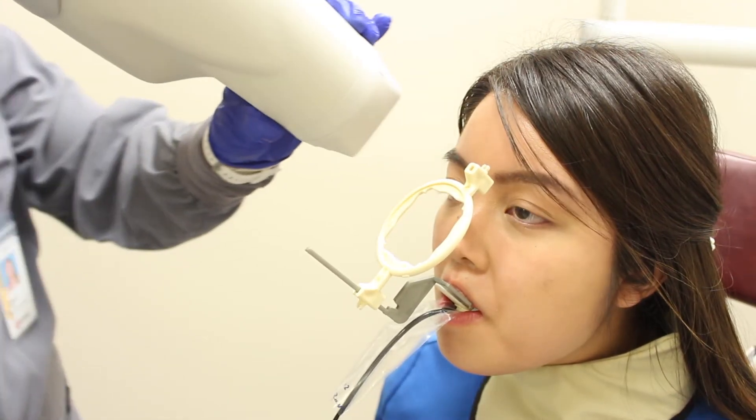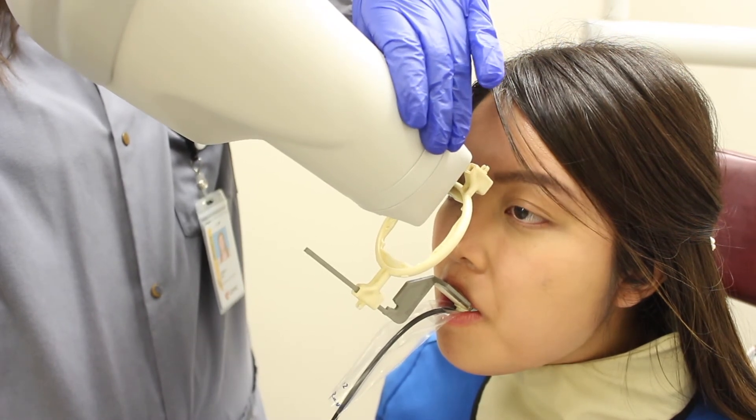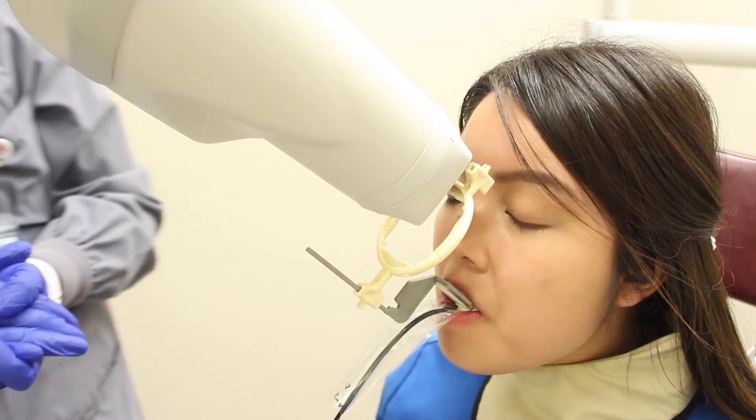To produce what we call a cone cut image, the sensor will be placed in the mouth the same way as the previous PA, but the PID will artificially be moved higher than the normal paralleling technique position. We have a cone cut at the inferior aspect of the radiograph. One way that the cone cut happens is when the beam coming out of the PID is not completely in line with the sensor.